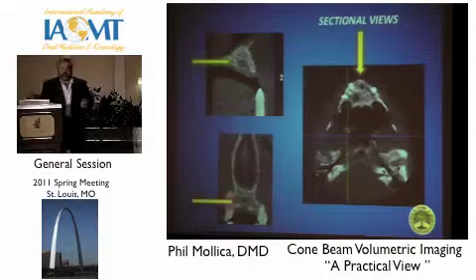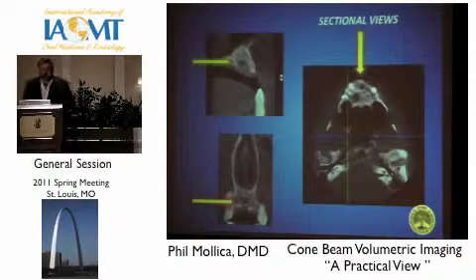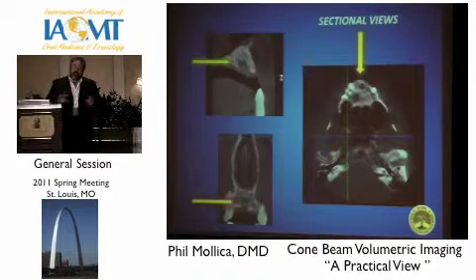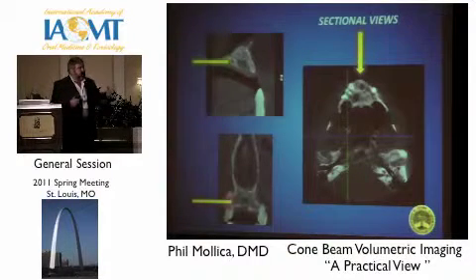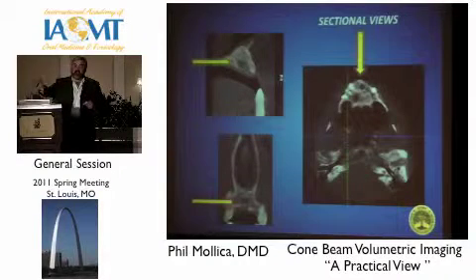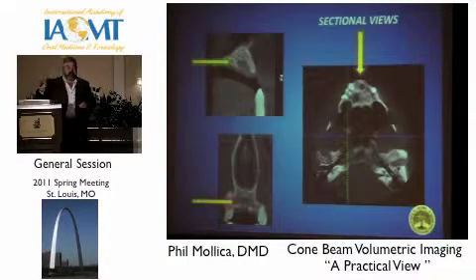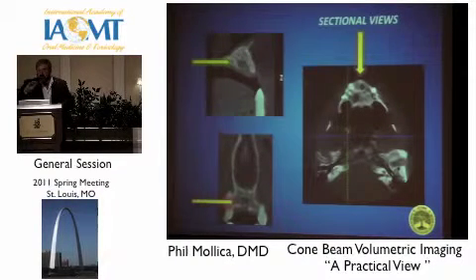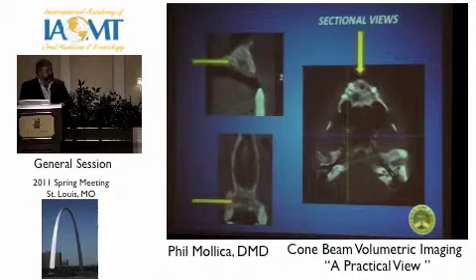Now, the beauty of the system is, in most of these radiology systems, when in doubt, refer it out. We have the capability of taking the information from the cone beam and just emailing it off to a radiology group. I use Radiology 360 down in Atlanta, so I hook it up. Software's right there, right down to the radiology group.